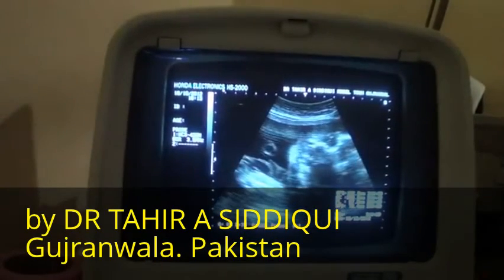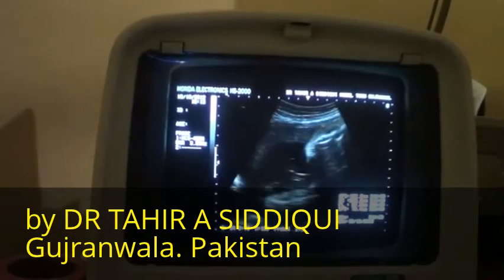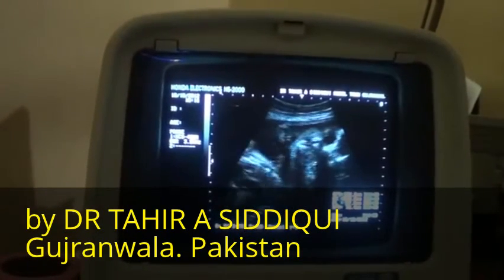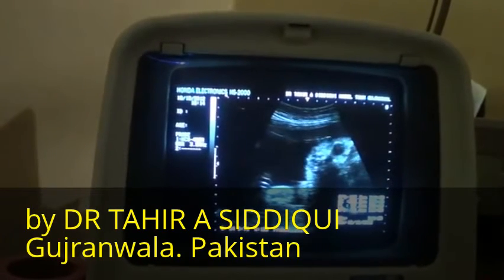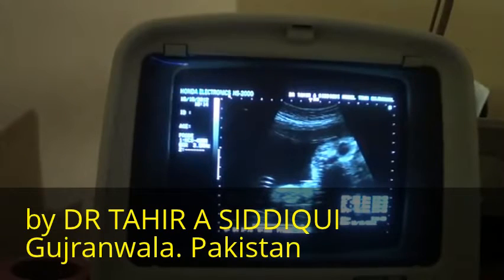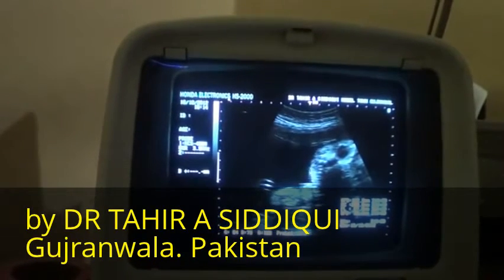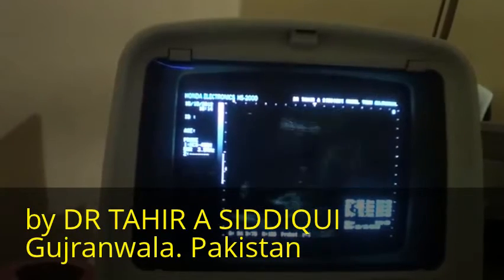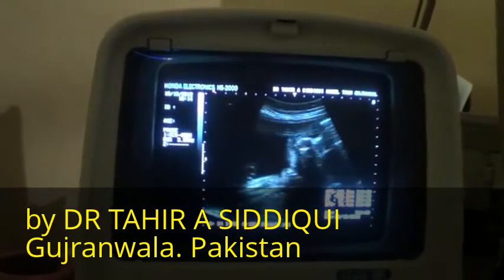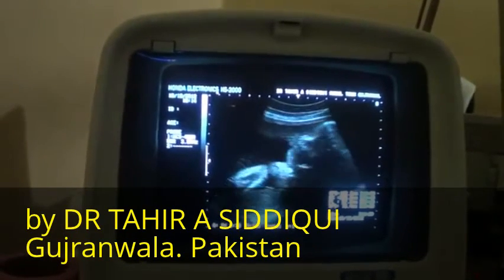This is the fetal face. This is the eye, and these are the facial features, which are normal.